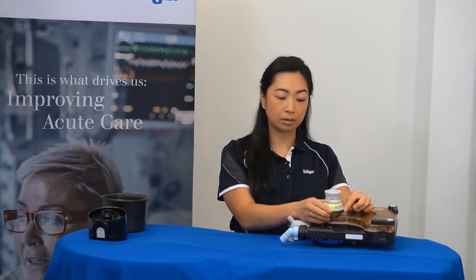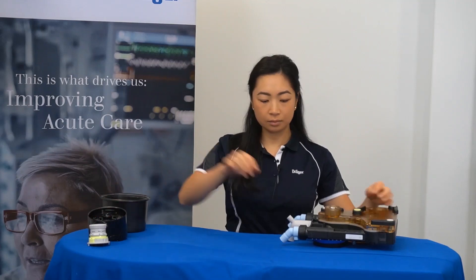You can then remove the APL valve by unscrewing the bottom component of the valve. Following that, the inspiratory and expiratory ports can be unscrewed from the block.